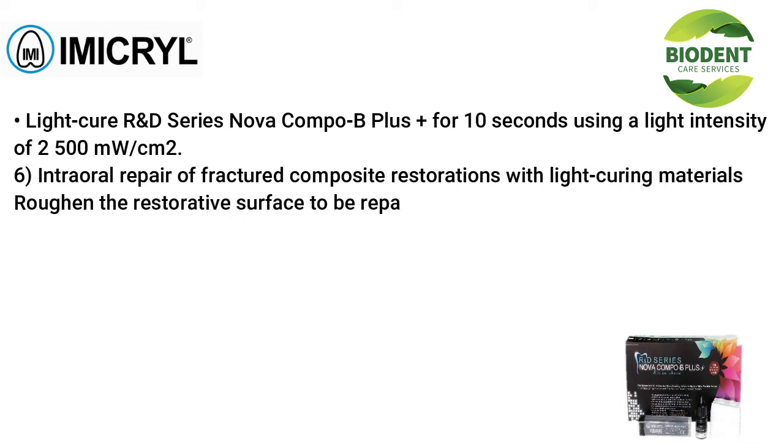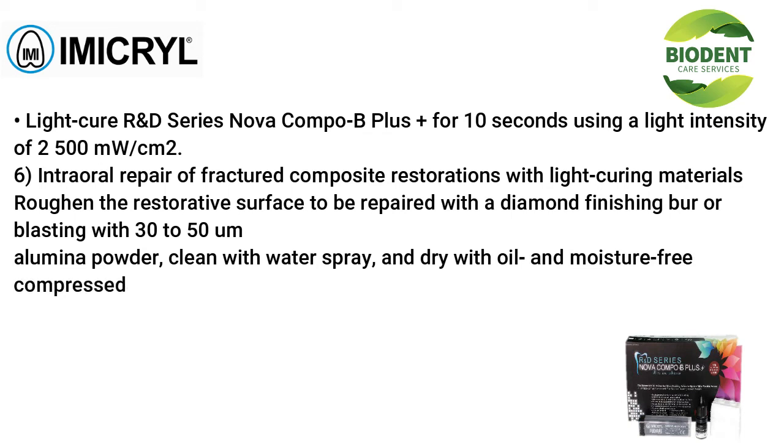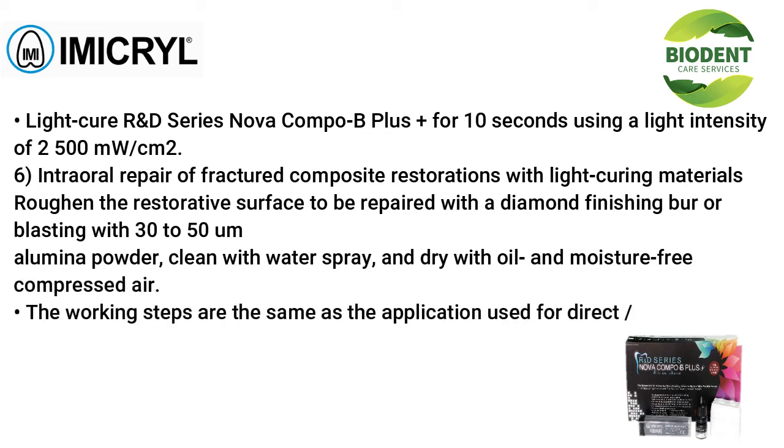6. Intraoral repair of fractured composite restorations with light curing materials. Roughen the restorative surface to be repaired with a diamond finishing burr or by blasting with 30 to 50 micron alumina powder, clean with water spray, and dry with oil and moisture-free compressed air. The working steps are the same as the application used for direct and indirect restorations with R&D Series.